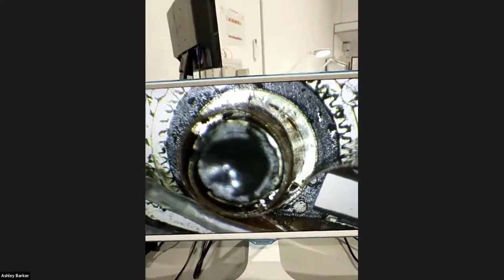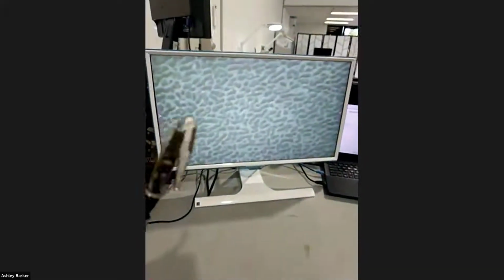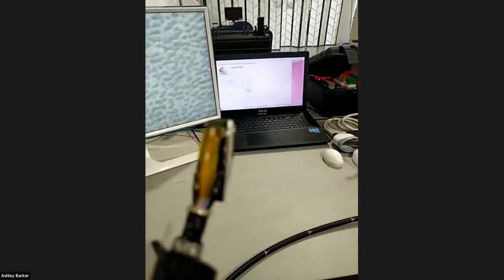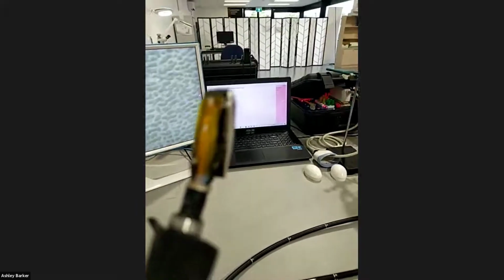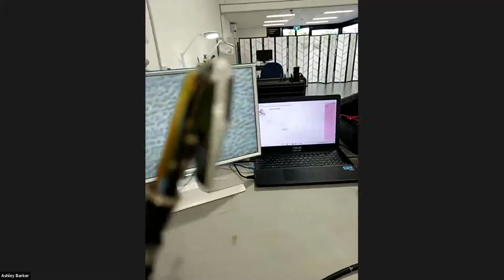Wow. So the other thing I wanted to show you is most TE probes now are going away from that mechanical design and going for more of this. So this is the GE 6VT, which has, how many elements in this? 4,800 elements in the tip. So it's a matrix array. So this can do the full 3D imaging of the heart from inside.